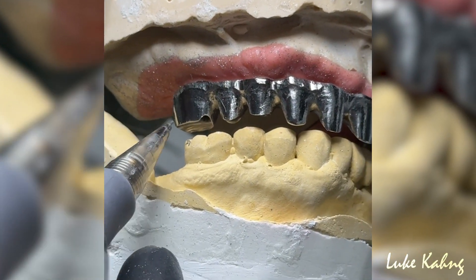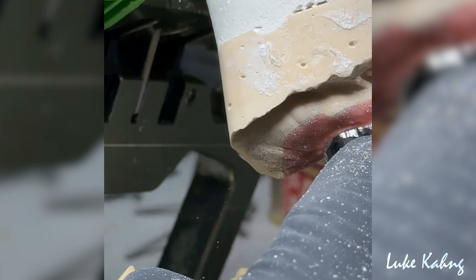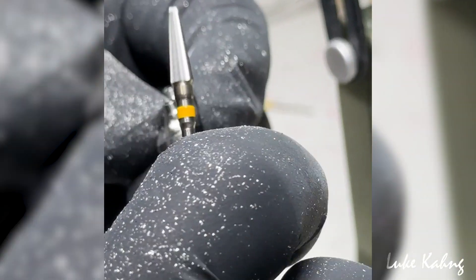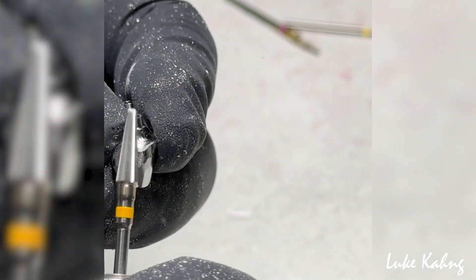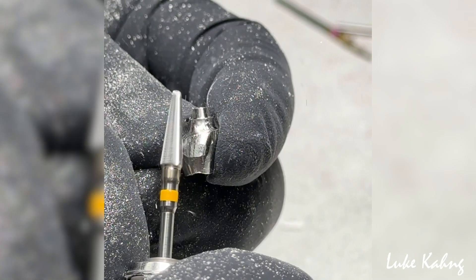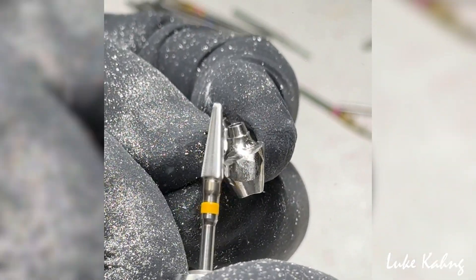It's too big because I don't need this here, so I'm going to cut it. I'm going to make these ovate forms and make cleansability underneath — it's very impressive. So I decrease the size of the tooth, so my final restoration will have great hygiene underneath. That's what I want.